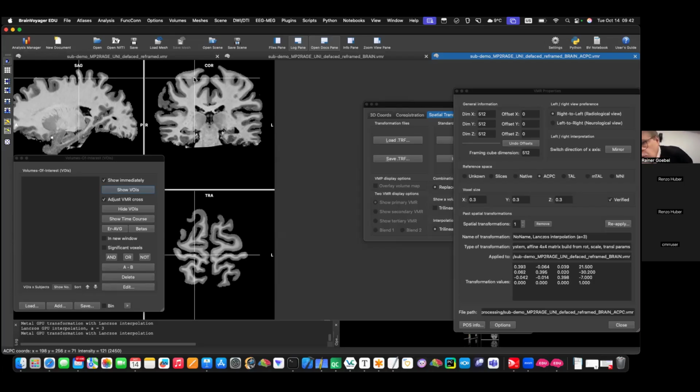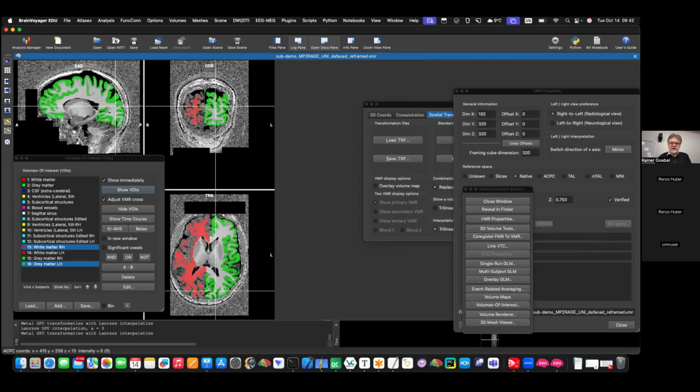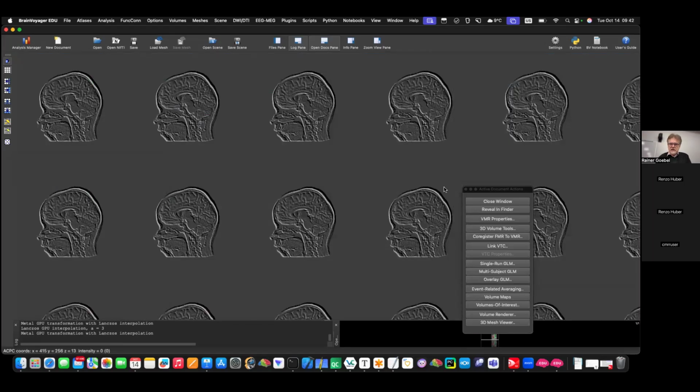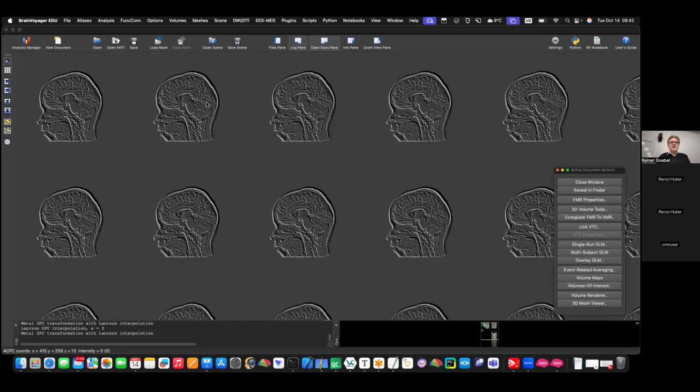One good thing would be to adapt it. So now you can just close all your VMRs which might be open. I think you had a good impression of how this DNN works and that you can post-process it. And now we upscaled it to 0.3 millimeter.